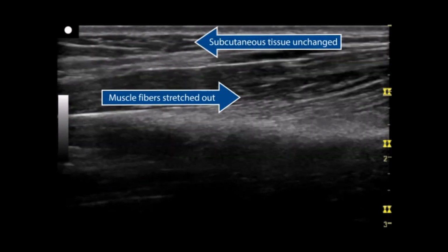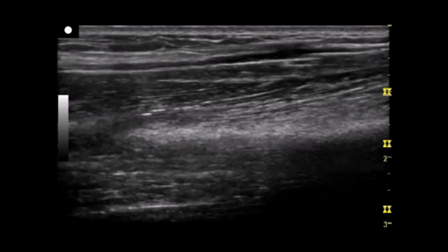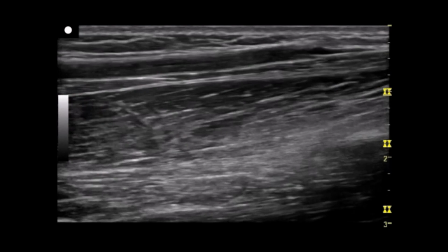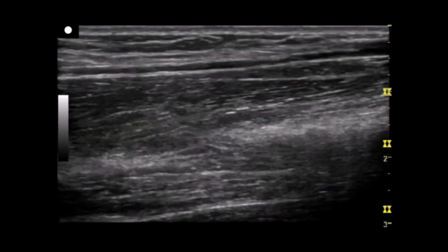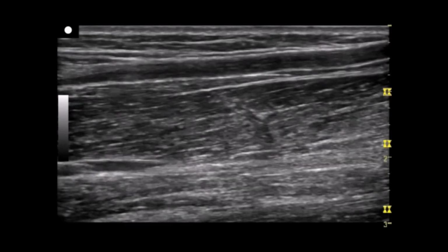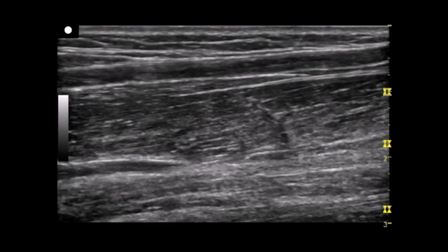Each of these hard and soft tissues will be discussed in greater detail in a subsequent lesson. In addition, an in-depth discussion of soft tissues is provided in the soft tissue module. A solid understanding of soft tissue sonography is integral to performing MSK sonography.